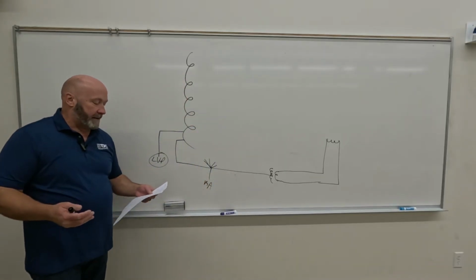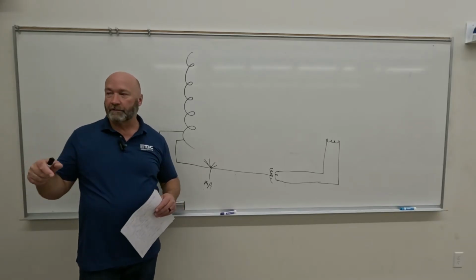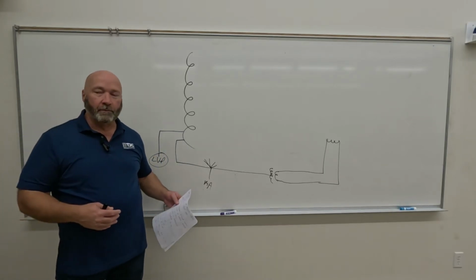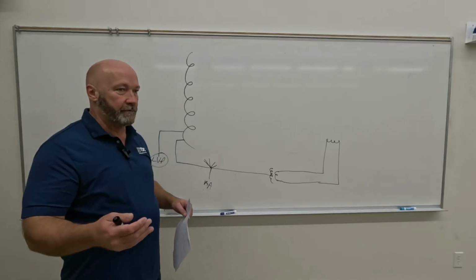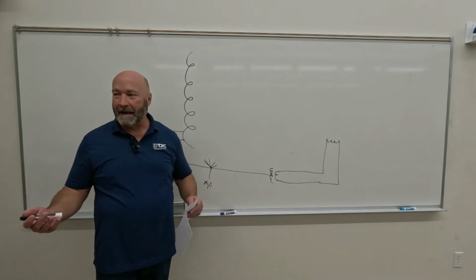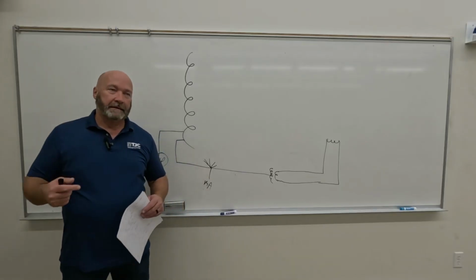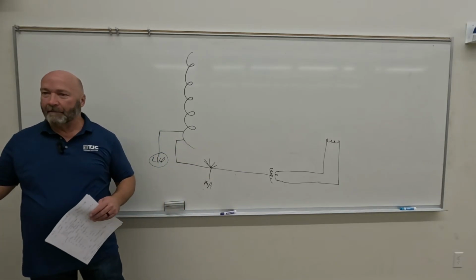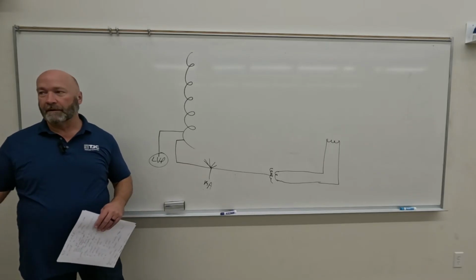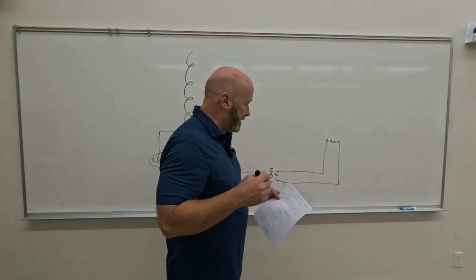So then we talked about mAs timers, and with mAs timers, what you have is a set mA station, and whenever you adjust your mAs, you're actually selecting a time, right? So mA station is usually 100, and then whenever you set your mAs, you're setting your time. So 100 mAs exposure. Let's say you're doing a cross table lateral L spine, which we'll get into Monday. Kind of high mAs, right? So 100 mAs on a cross table lateral L spine would actually be 100 mA at 1 second. It'd be a 1 second exposure. So we talked about that, and then we talked about AECs.